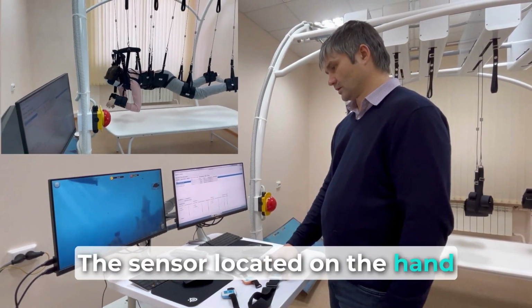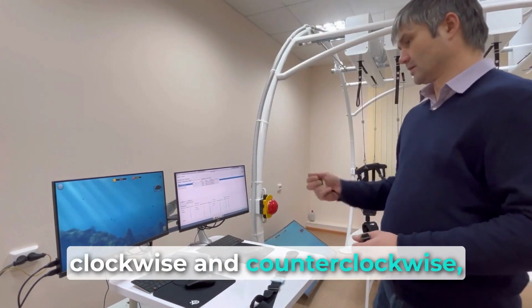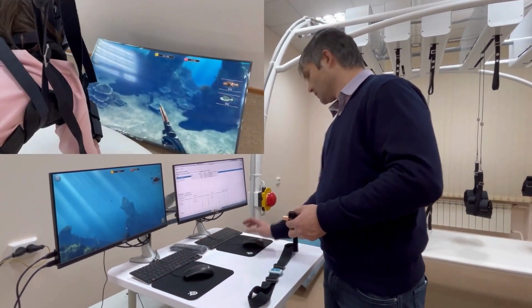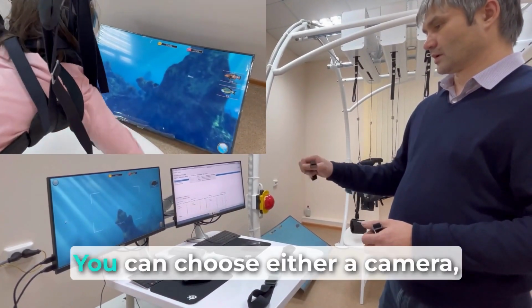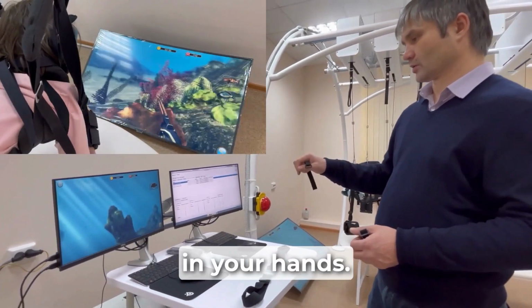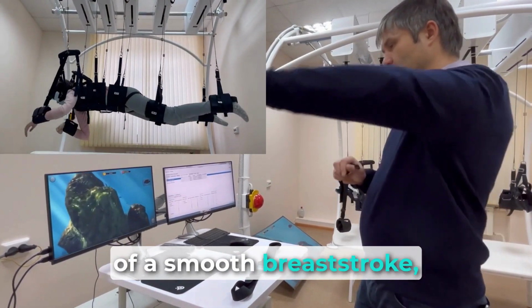The sensor located on the hand recognizes the following gestures. By sharply turning the wrist clockwise and counterclockwise, supination and pronation must be performed. Objects in the hands are changed. You can choose either a camera, or a harpoon, or without an object in your hands. During the game, the sensor recognizes the style of a smooth breaststroke.